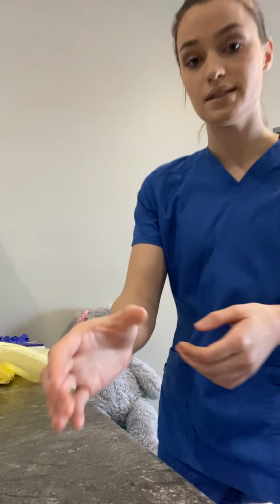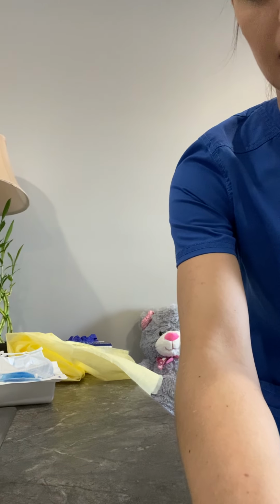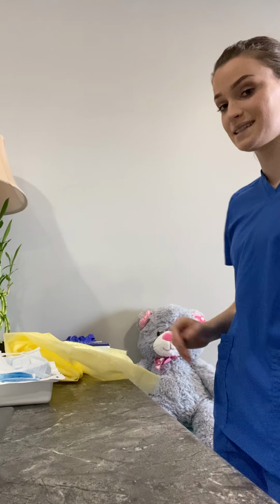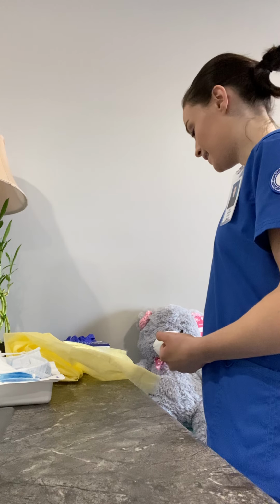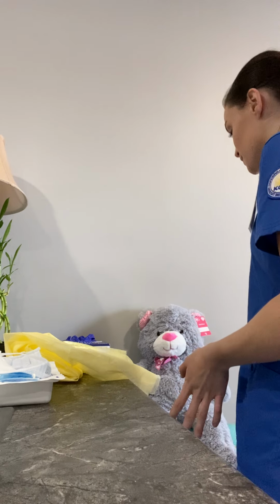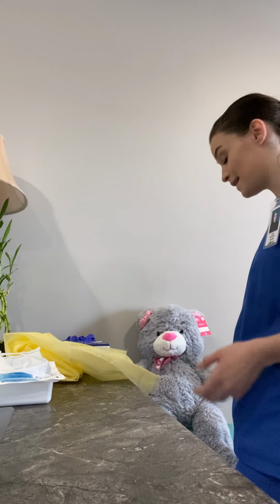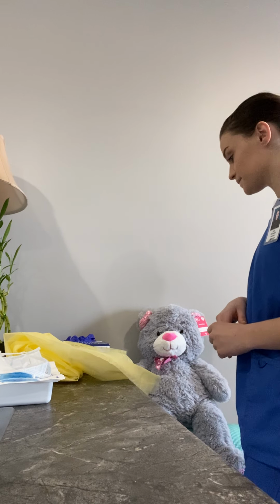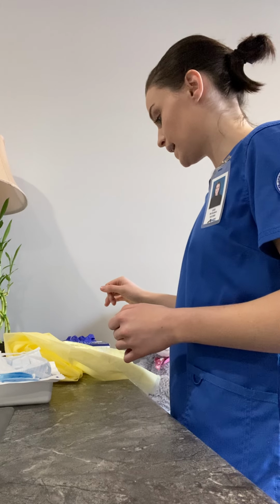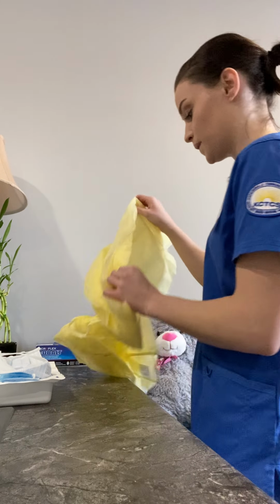So first, I'm going to do the dressing change for my patient. A lot of this I'm just going to have to verbalize because it's a teddy bear. So first, I'm going to let my patient know what I'm doing. So we have to do a dressing change today, Miss Teddy. Got to get you a clean dressing on there. So I'm going to go ahead and I'm going to put my gown on.